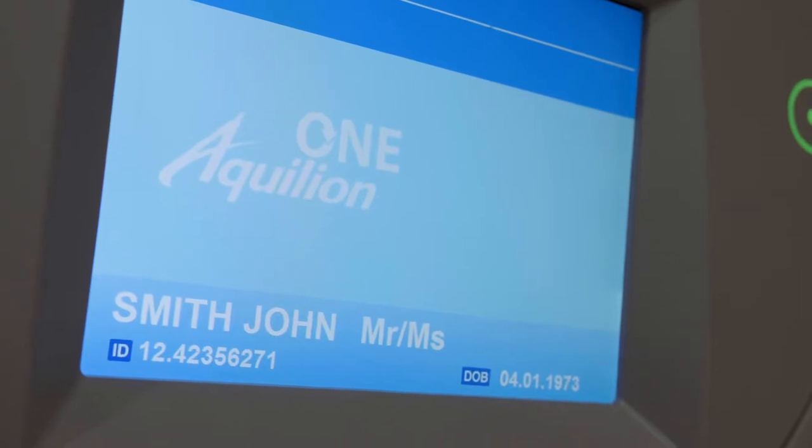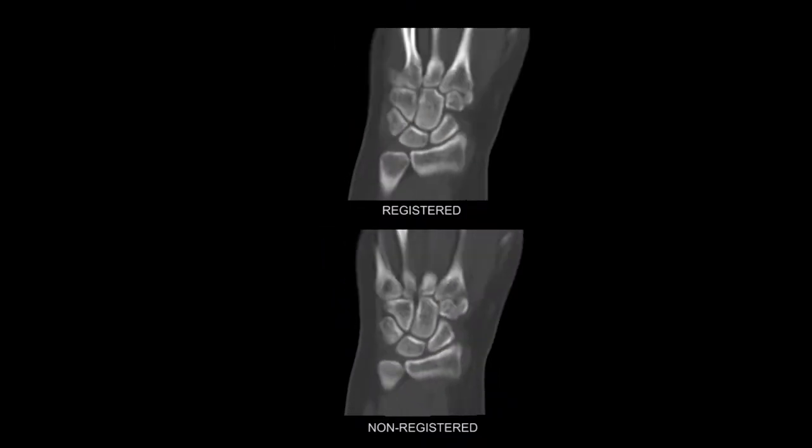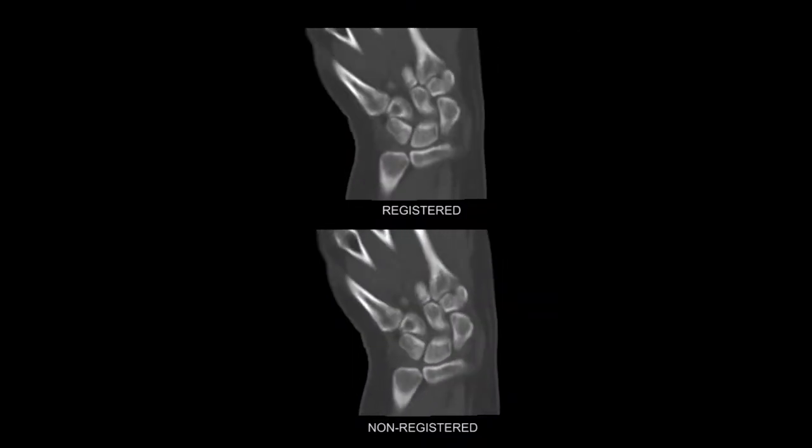Dynamic imaging with the Aquilion ONE enables us to put patients in positions which reproduce their symptoms due to impingement or instability, and to identify the ligaments which are injured by showing abnormal movement of those bones.